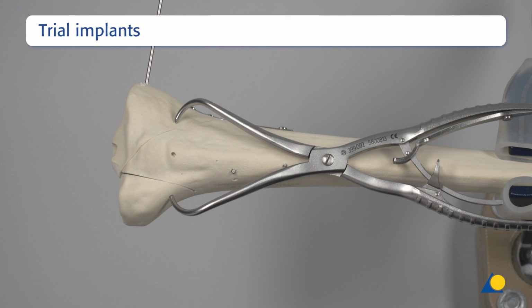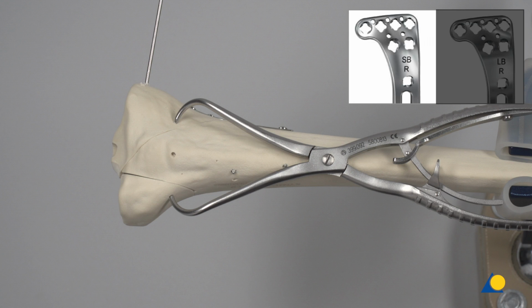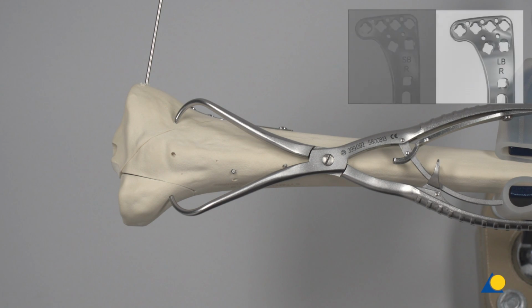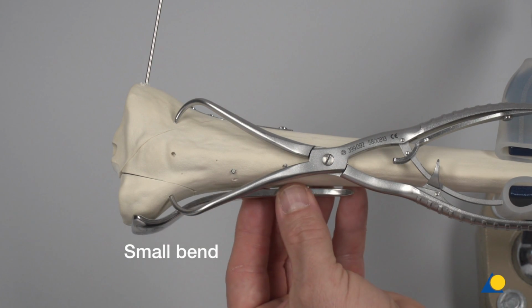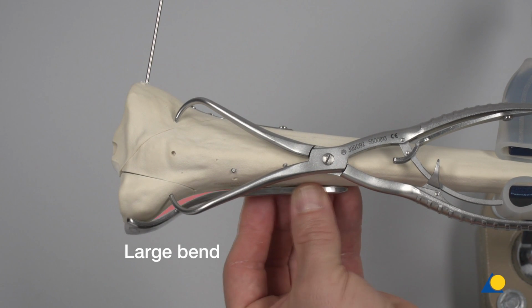VA LCP proximal tibia plates are available in small and large bends to accommodate varying tibial anatomies, and marked SB, small bend, and LB, large bend. In the clinical situation, both the small bend and large bend trial plates would be positioned on the proximal tibia to determine the best fit. Be aware that the fractured bone may be broadened, leading to misidentification of the best fitting plate. In this case, image intensification of the contralateral knee taken during preoperative planning may be useful for comparison in order to identify the most suitable plate bend.